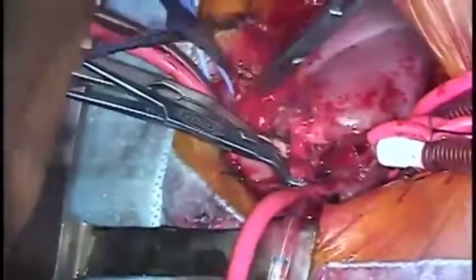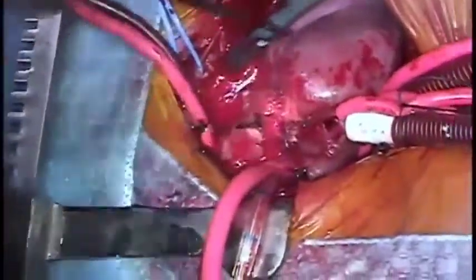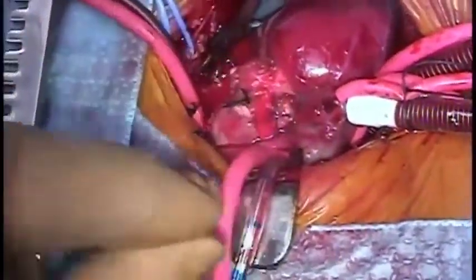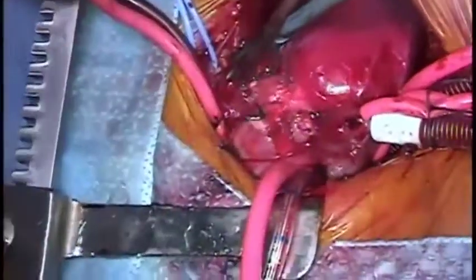The final suture is tied down, allowing the clamp to be released after a total of 146 minutes. If the coronary reconstruction is satisfactory, the heart will usually start beating after a few seconds, even though the temperature is still 14 Celsius. This sequence is shown in real time to illustrate this fact.